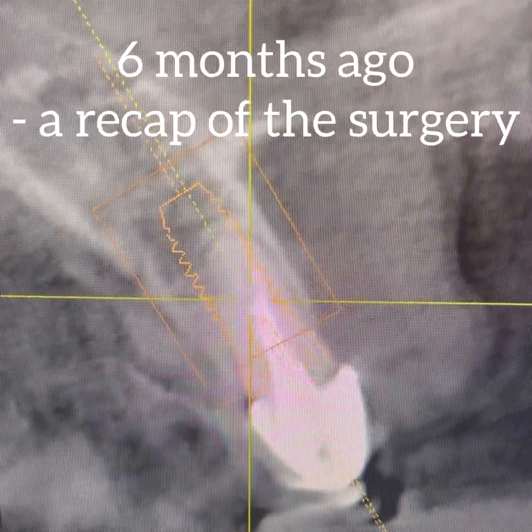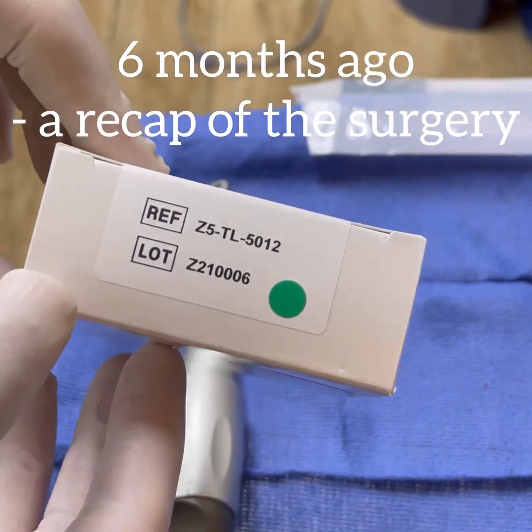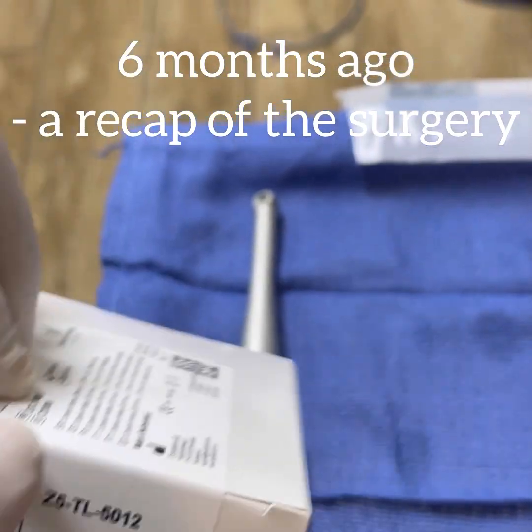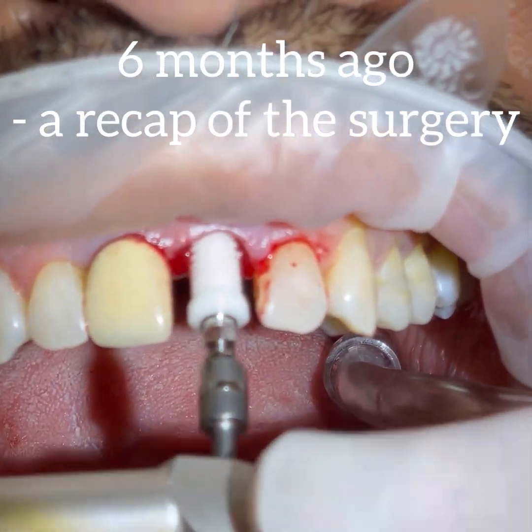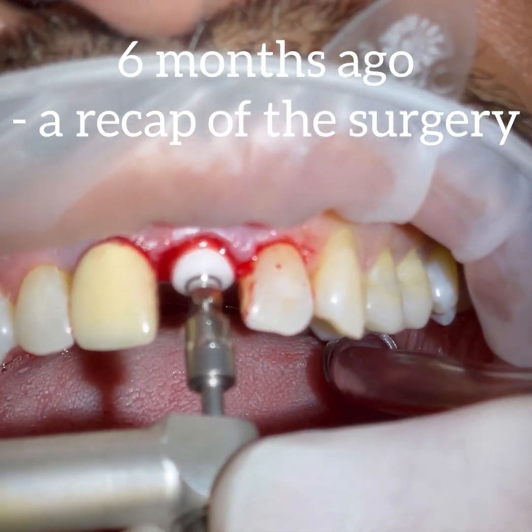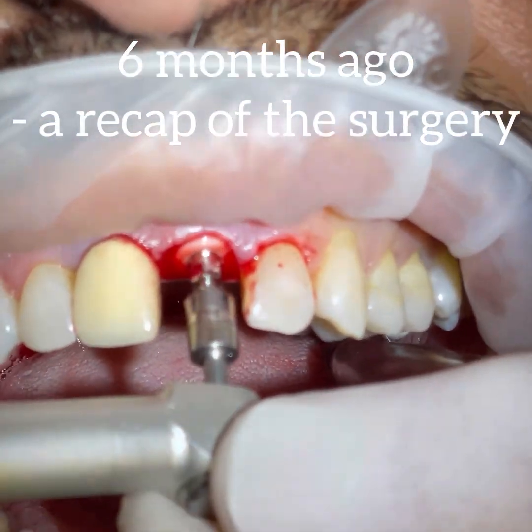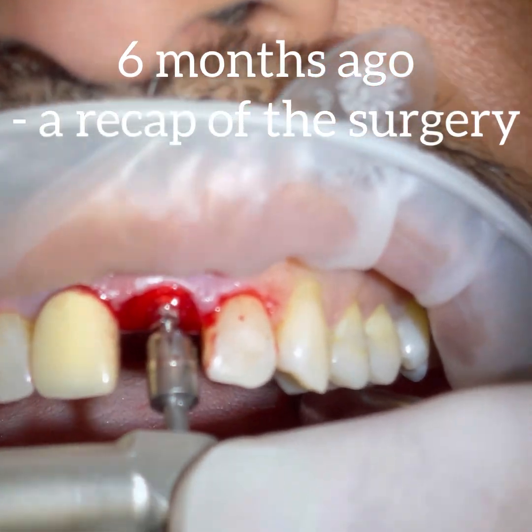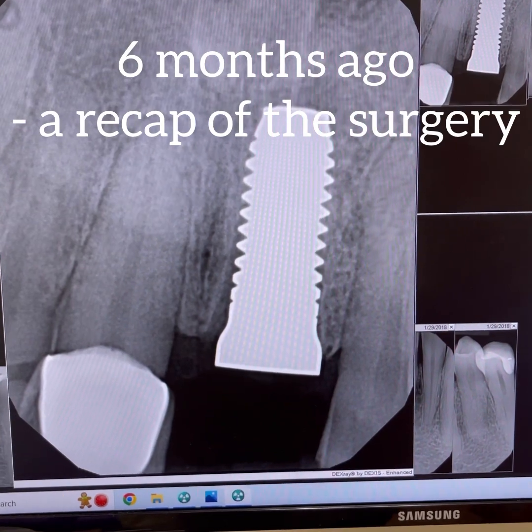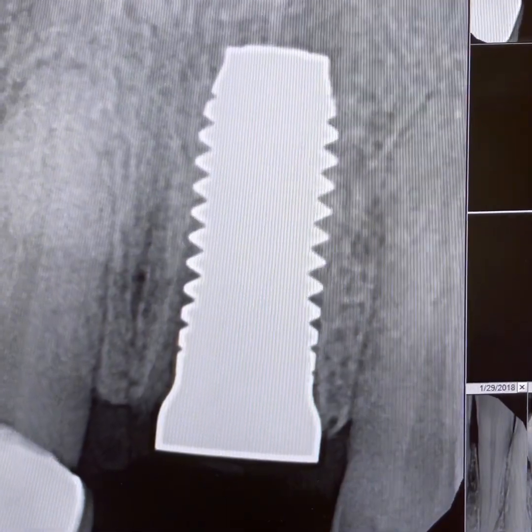This is just an introduction for what is coming up in the restoration phase, which we did today. Z Systems is a Swiss company which manufactures a wide range of very versatile ceramic zirconia implants. The tissue-level versions are one of my favorites because, first, there is no gap or interface in the sensitive biological zone, and second, the wider tulip acts as a nice foundation and support for my future keratinized gingiva.